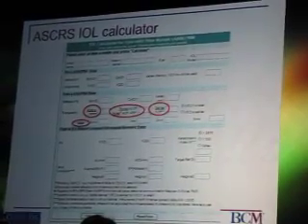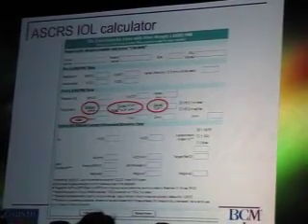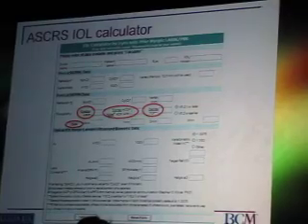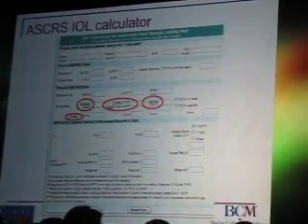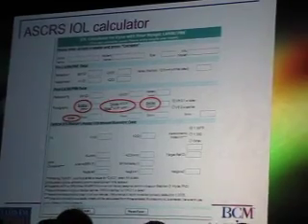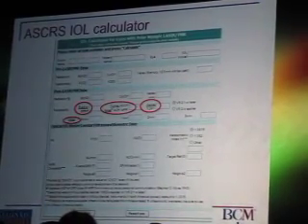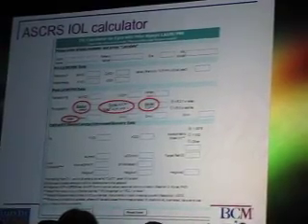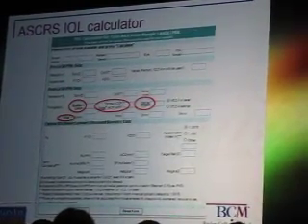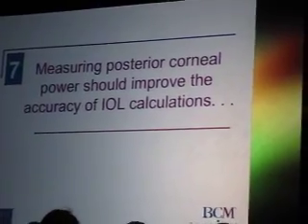And in the ASCRS IOL calculator, several of the formulas rely upon corneal topography values that are average values over central zones. But I should point out that there are some excellent formulas that also use just the 6 or so points from the IOLMaster, or the 12 or the 24 from the LENSTAR. So again, we have a way to go to refine all of this.